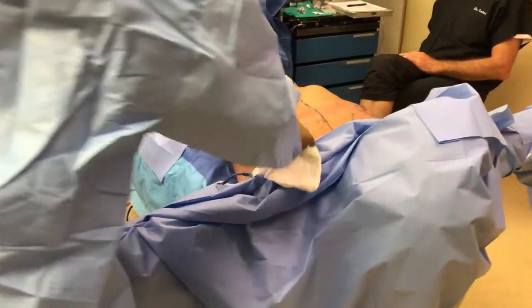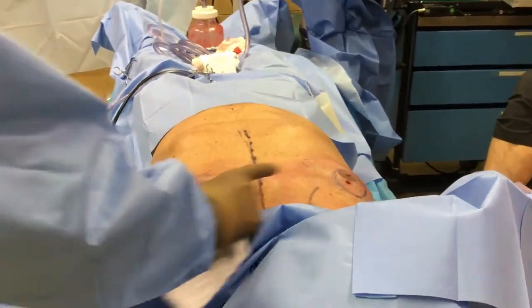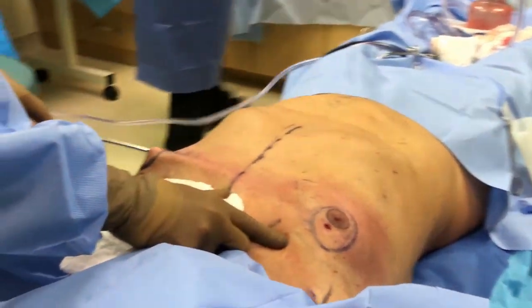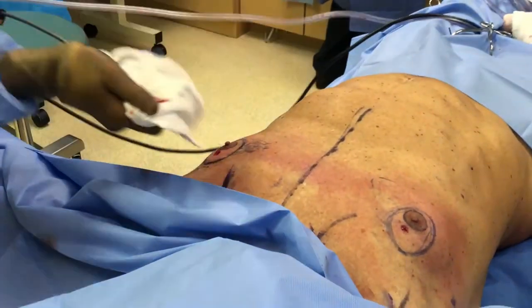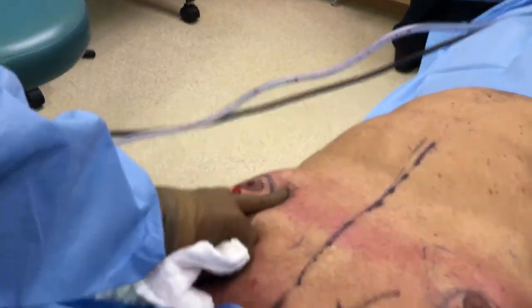So we do start with our liposuction. I've already done a little bit — this is like a cooking show, something we've already done. Go across this way, and then we're going to go up into this direction. Patient's moving just a little bit. Up in this direction.